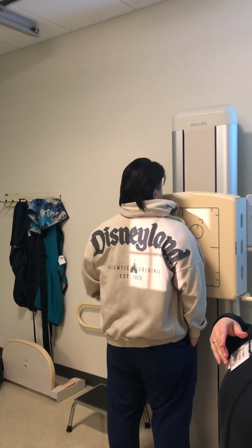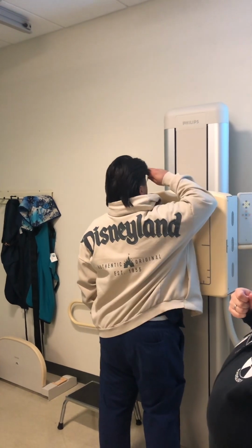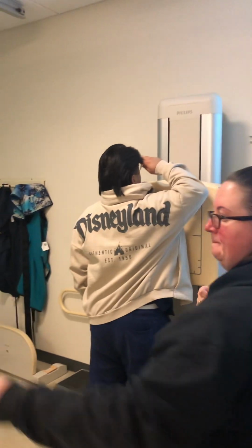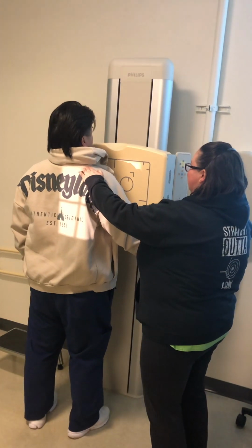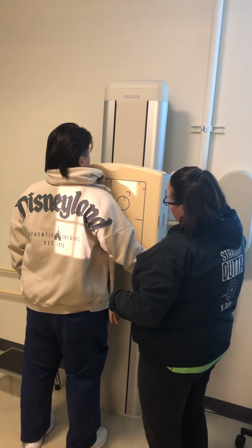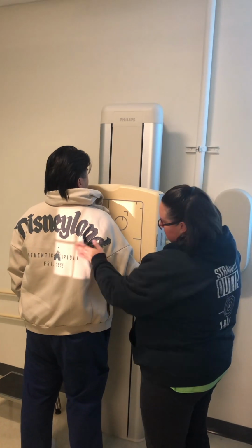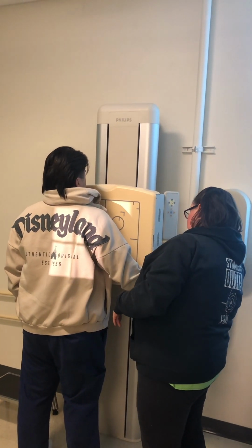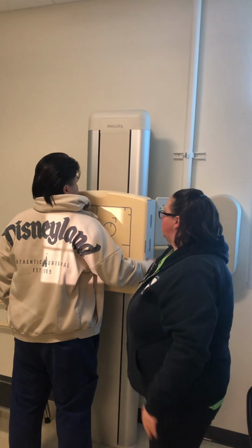Get the scapula out of the way of the ribs. Can you do that again? I was curious to see if it would cut off the top there. It looked fine when his arm was down, but then he took that breath in, and I'm like, ribs 1 and 2 are up so high. It might be close, but I don't know that I would cut it. I don't know that I would go up too much higher, but maybe a smidge.